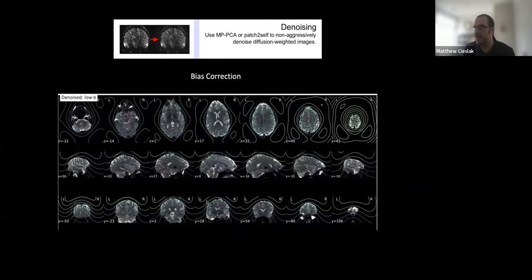The next denoising report that we see is the bias field correction. The raw image is displayed, and then after it's had its intensity normalized, you see what that version of it looks like. And the actual bias field itself is plotted as a contour map. This one looks like it had higher intensity near the coil, for example, and lower intensity in the middle. And after bias field correction is applied, it looks much more uniform across the slice.